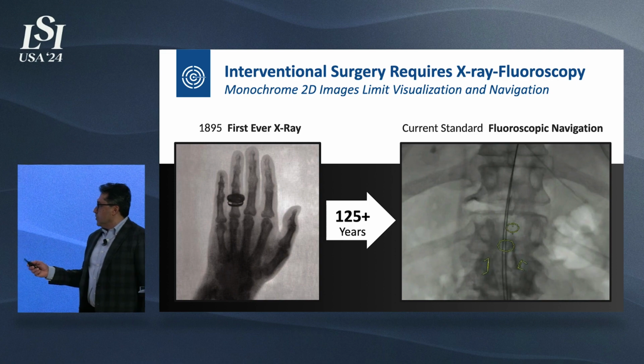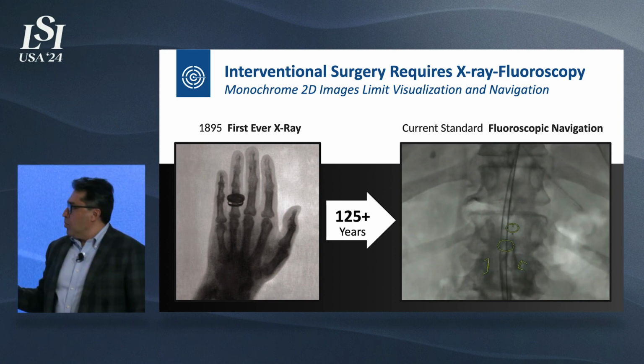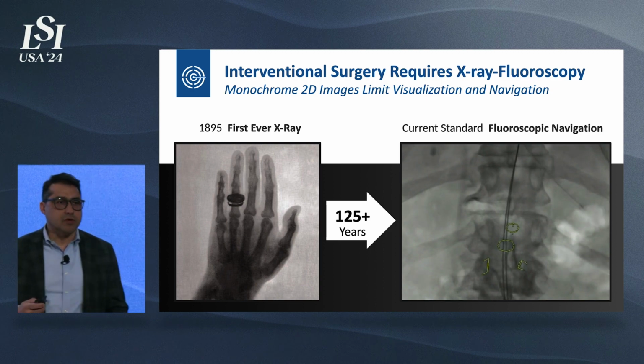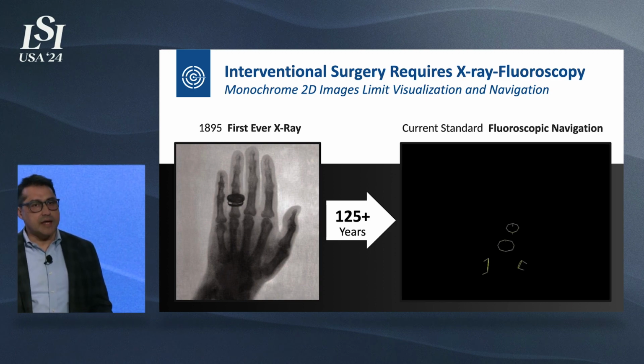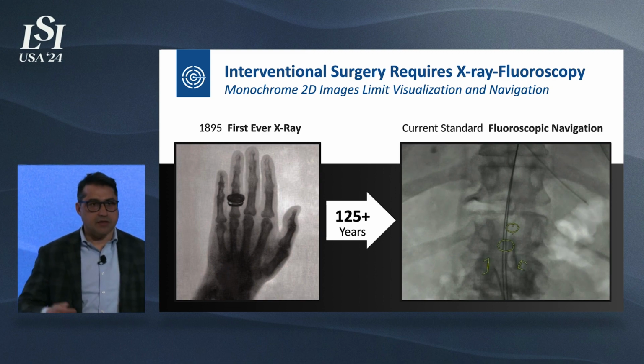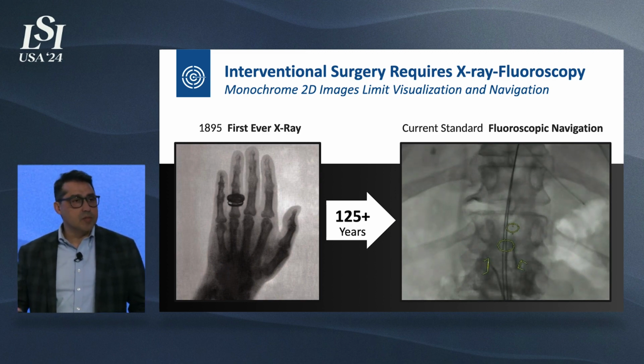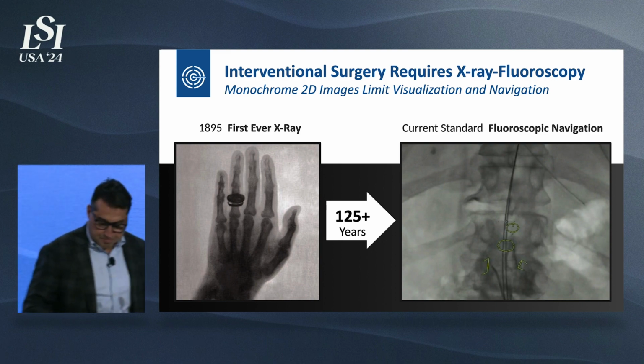Now, the ultimate goal of this procedure is to place a stent graft. Before that happens, and I'm going to really simplify a lot, the team is going to have to do a series of navigation tasks that basically involve moving guide wires and catheters through the vascular system into position in the aorta and into some of the vessels that branch off of the aorta.